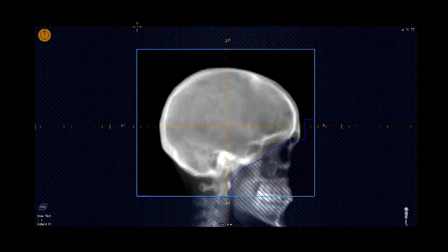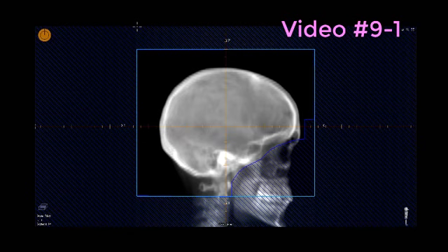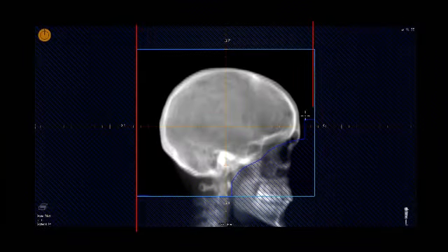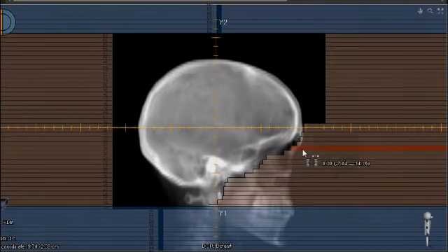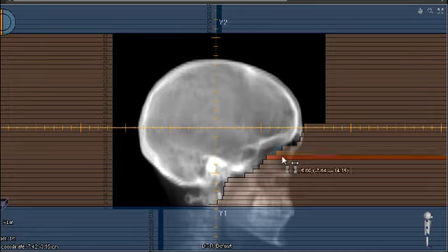So you'll remember from video 9.1 that we talked about the collimation system of the linear accelerator. We talked about how there are the jaws out here that define some field size, and then there's some blocking. And the blocking might be accomplished with MLCs, and we had a whole discussion about that. So these SC and SP factors are related to those.